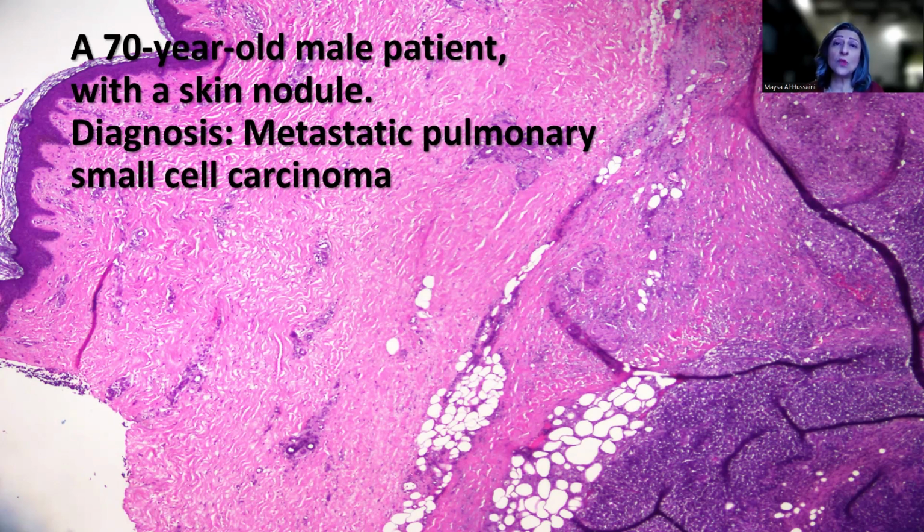in this case, as the patient succumbed to the disease shortly after confirming the cutaneous metastasis from the pulmonary small cell carcinoma. I hope you find this tip useful in your daily practice.